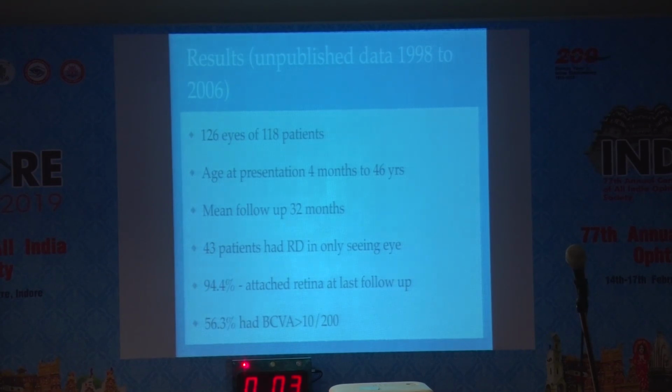One, having a good thorough vitrectomy, 100% induction of PVD in all cases, and detaching the vitreous as far into the periphery as possible, debulking the peripheral vitreous nicely, and treating all the way along the ora. The initial mistakes we made, especially when we were using Machemer's lens or not a wide angle lens, was leaving behind too much peripheral vitreous and having a peripheral dialysis which went undetected. And when you remove the oil, you find that the dialysis is causing the detachment again. So now that is not a problem with a wide angle lens, a good thorough vitrectomy, and treating the entire peripheral ora; the risk of recurrence has been minimized significantly.